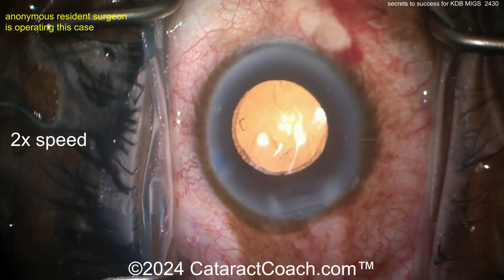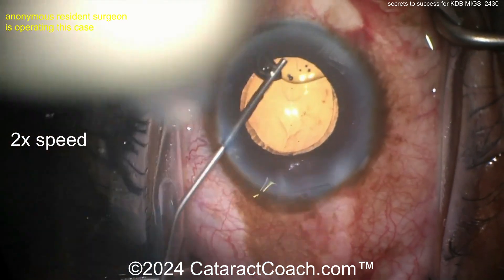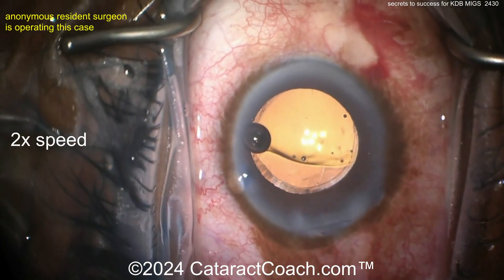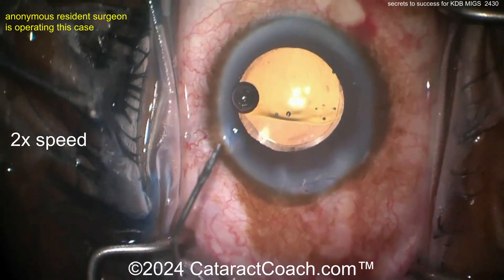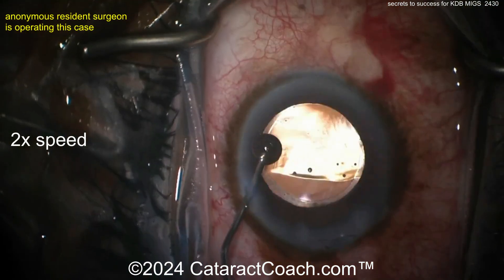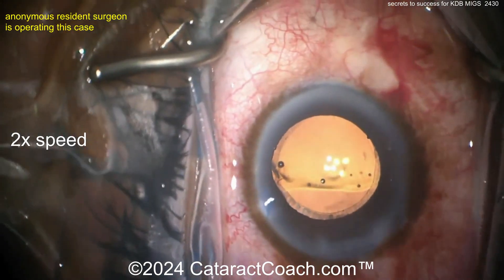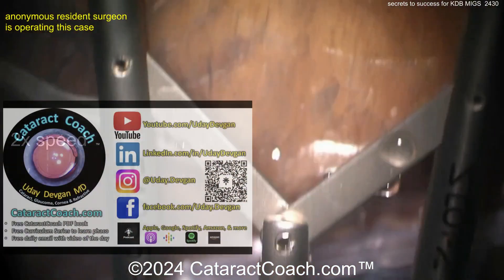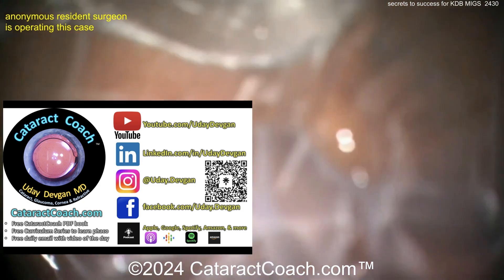Notice the main incision is not nicking the limbal vessels, which is important here. If you nick limbal vessels and then put up your gonio prism, you may get poor visualization if there's blood on the surface. The incisions are just a little bit inside the limbal vessels so you don't get any bleeding there. Now it's time to do the gonio prism.